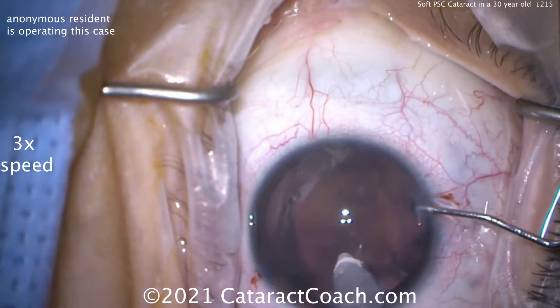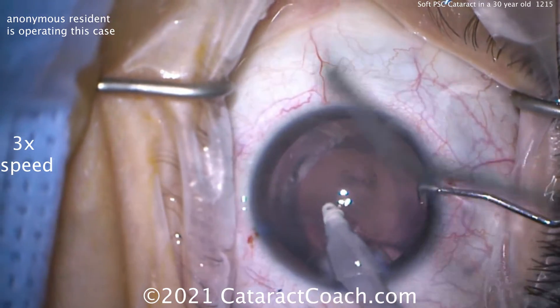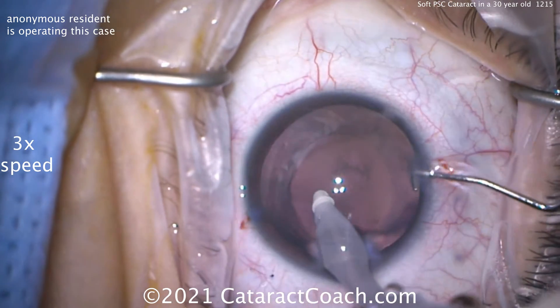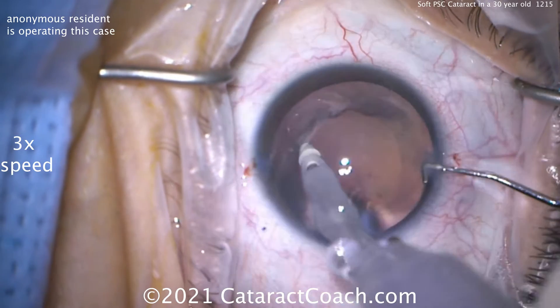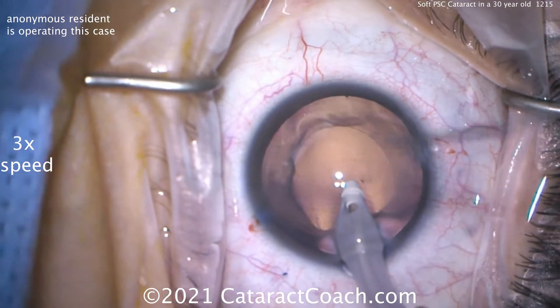Remember, young patients like this are almost guaranteed to get PCO — posterior capsule opacification — and that's likely going to happen in the first year after surgery due to the patient's age. Now look at that posterior capsule. It was cleaned up beautifully with the IA probe. Nice and easy. That went in great.